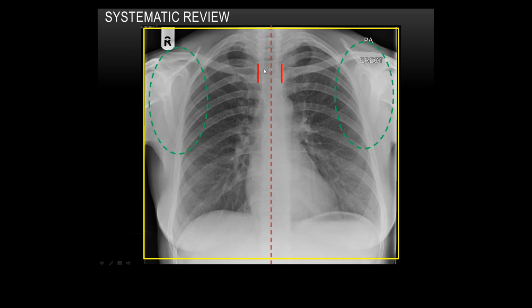So I can actually draw it on here. If this is your detector, you get your patient stood up right there, the heart is an anterior structure, and your X-ray tube is here. When your X-rays come out, they come out from a focal position on the tube. They don't come out straight, they bleed past. So that is how big the heart is going to be on a PA chest X-ray.